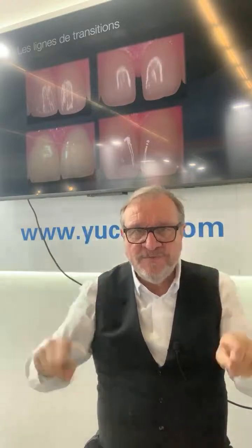At the end, the granulometry, it's the surface of the vestibulary wall, which is also important, and the transition line also. I take picture with a flash, and the flash show me the line and the transition line, and I have to symmetrize all that.